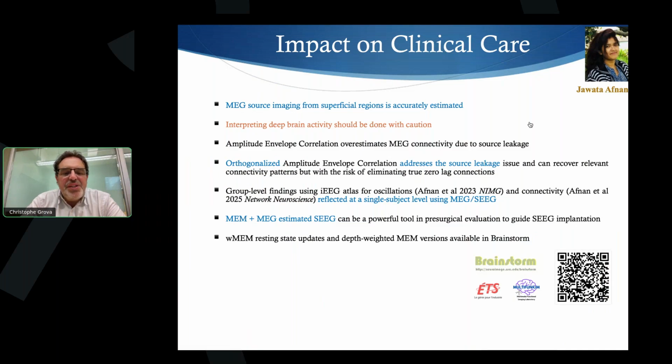And people who have been using simultaneous recording have shown that if you average based on the SEEG of a deep generator, you're going to see its trace on the surface. But when you start from the surface, it's getting really challenging to see it. So I believe there are ways we can address it. We need more efficient signal processing, perhaps AI or other approaches, to be able to extract it, because it's clearly embedded in the noise.